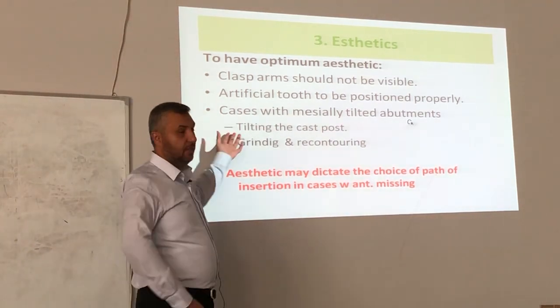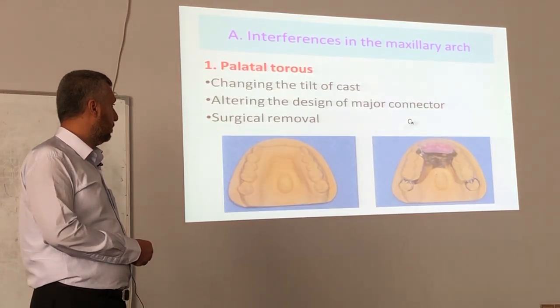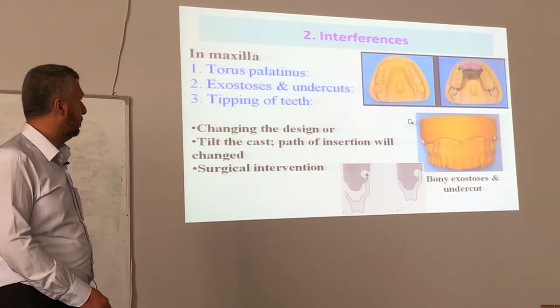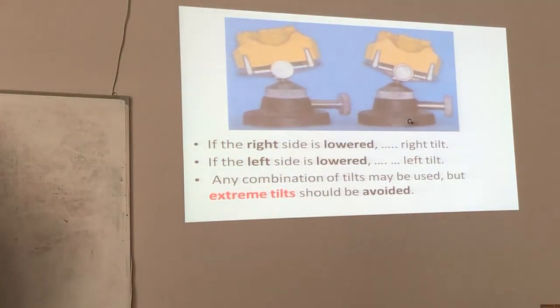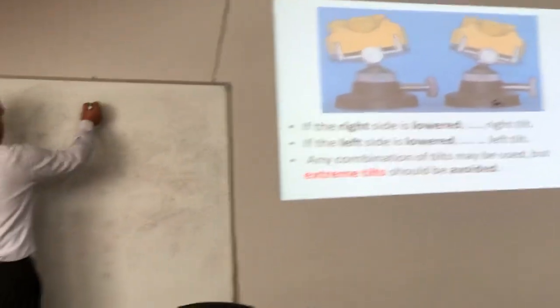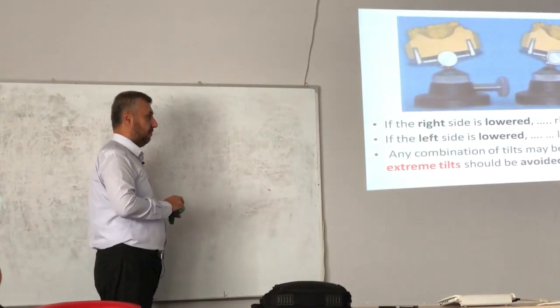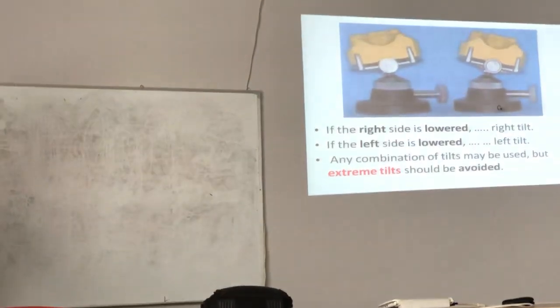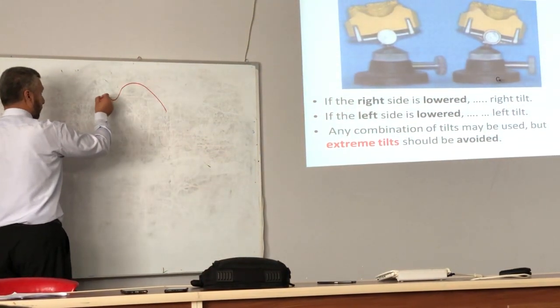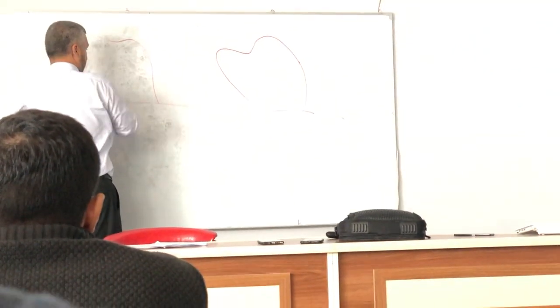We have more problems in case of tilting of the teeth. In case of a tilted tooth, this is the molar, this is the cast, this is the tilted tooth.